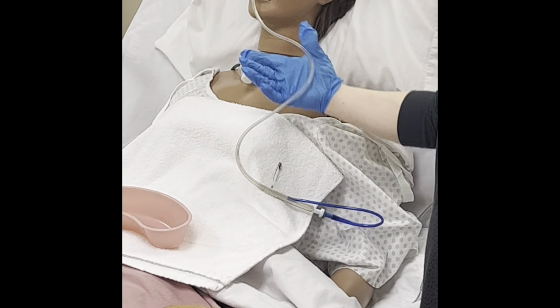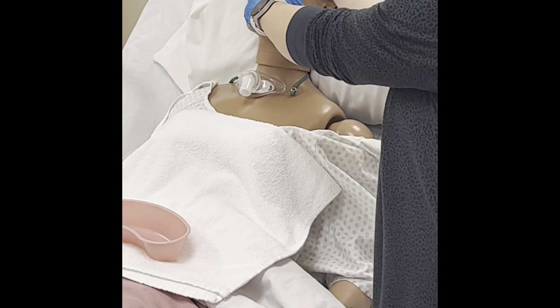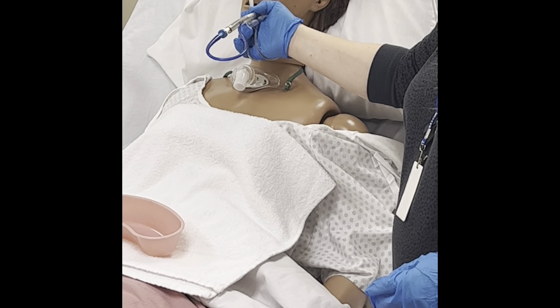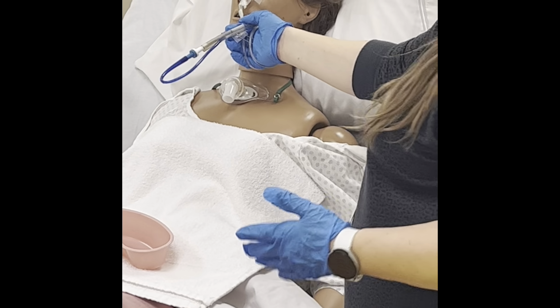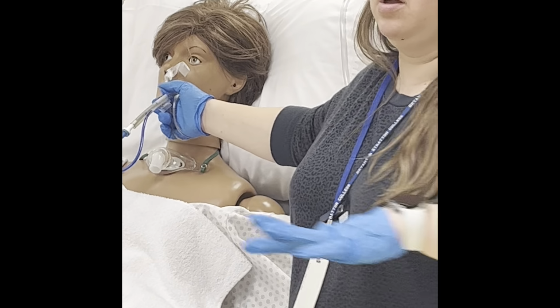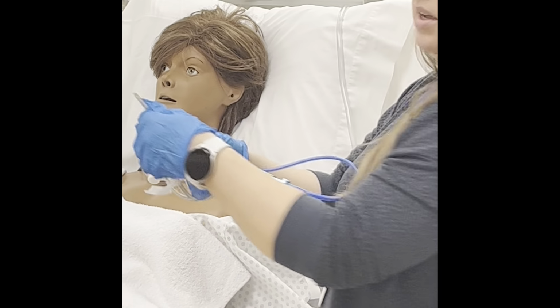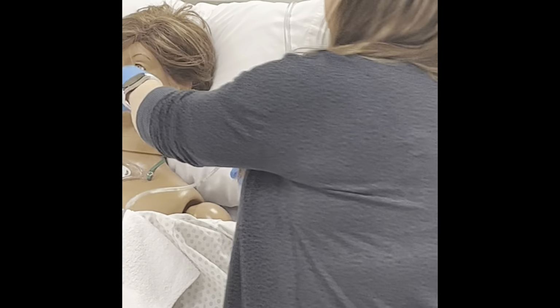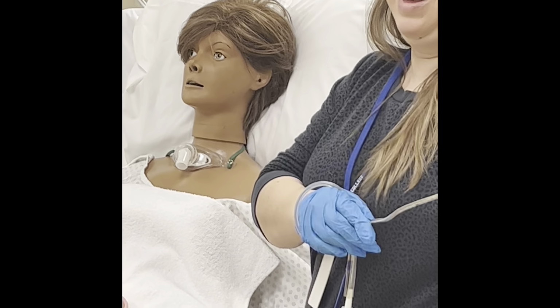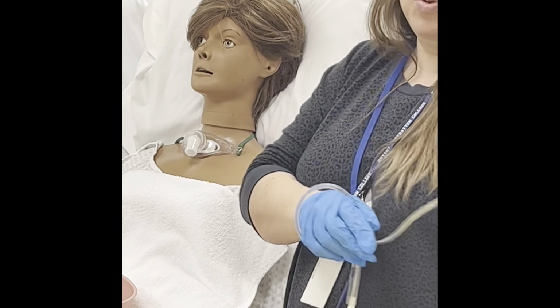So what we're going to do is we normally take the bottom of the tube and you wrap it around your hand, and I'm just going to keep wrapping it as I pull it out. Does that make sense? So I'll tell them, take a deep breath in, blow out your candles, take a deep breath in, and when they take that deep breath in, I'm just gonna pull it as I wrap it around my other hand. Why we do that is because if I didn't, the end of the tube usually has stuff on it, and it will go everywhere.